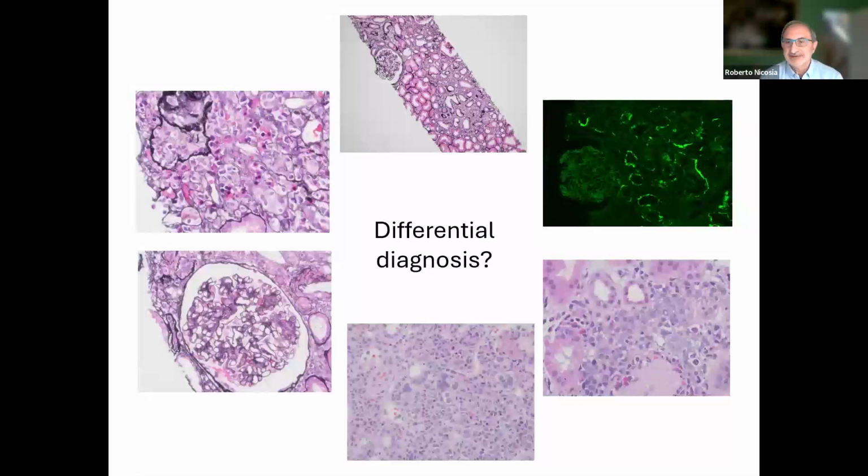Any volunteers? Well, I can tell you what my differential diagnosis was when I first saw it. It included, of course, at low power, the main concern was interstitial nephritis. But then as I look at high magnification, I had other thoughts in mind.